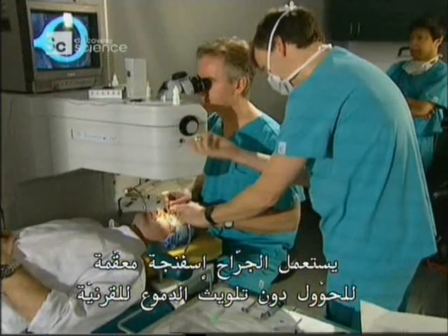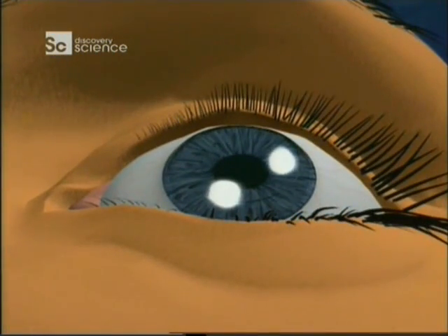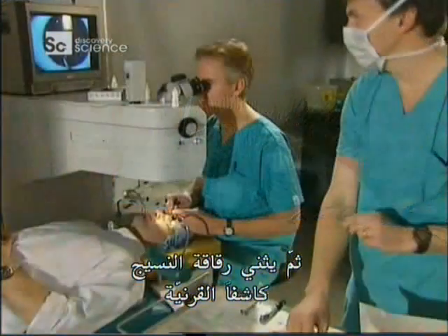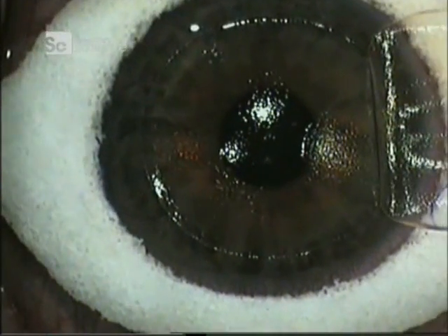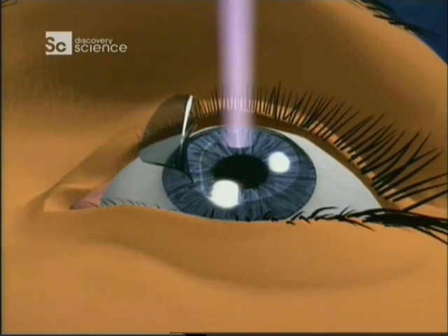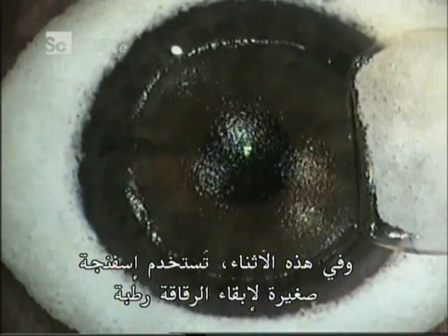The surgeon uses a sterile sponge to keep tears from contaminating the cornea. He folds back the flap of tissue, exposing the cornea. Meanwhile, a tiny sponge keeps the flap moist.